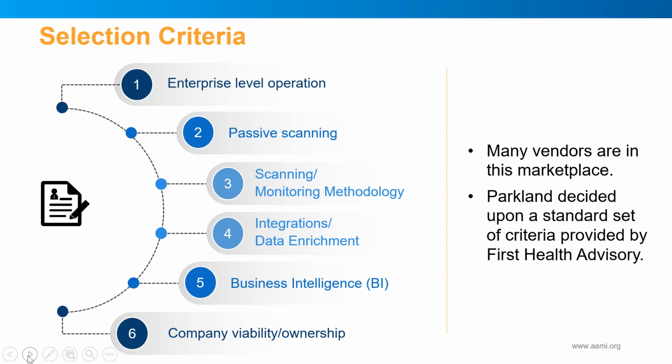So our network visibility devices are helping us shore up our inventory of our IV pumps, what software version is running on each pump individually. IV pumps are just one example, but it applies to everything that we have on our hospital network, including our closed patient monitors, central stations, so on and so forth.